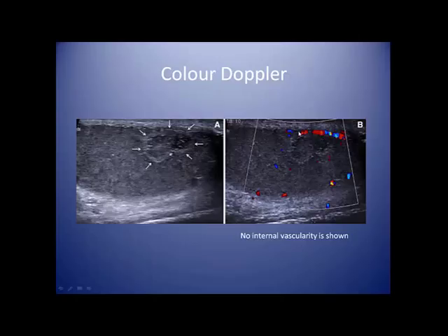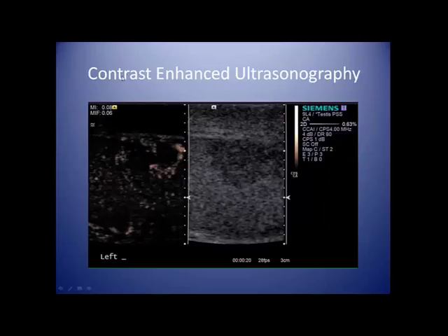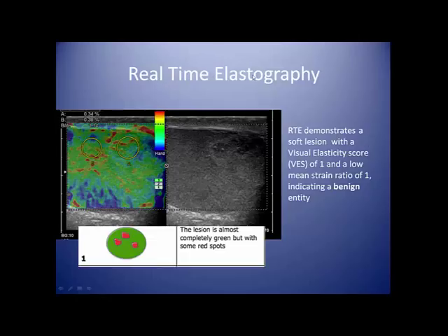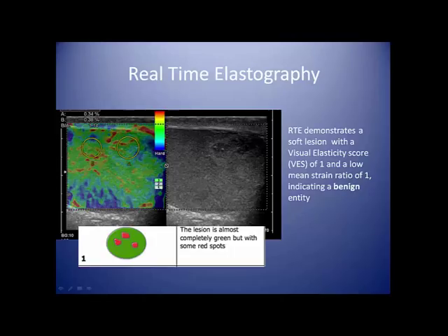B-mode ultrasonography images of the left testis demonstrate a heterogeneous lesion with an incomplete hypoechoic rim and iso-hypo and hyperechoic areas. On applying colour Doppler there is no internal vascularity, and on injection of microbubbles — sulfur hexafluoride gas — there is no internal vascularity with perhaps a suggestion of a rim. With real-time elastography the lesion is completely green but with some red spots: a score of 1 and a low mean strain ratio of 1, indicating a soft lesion with benign etiology.